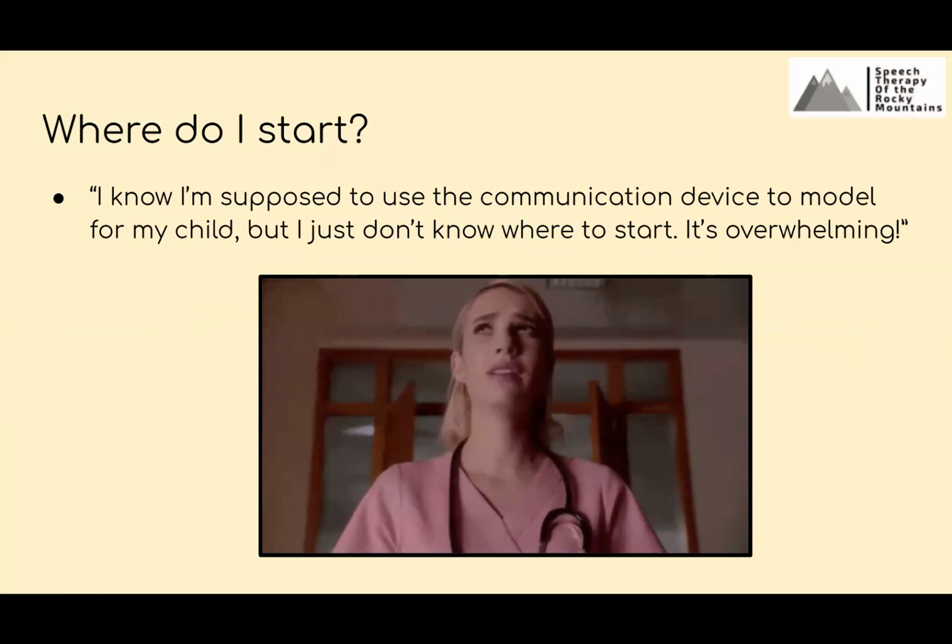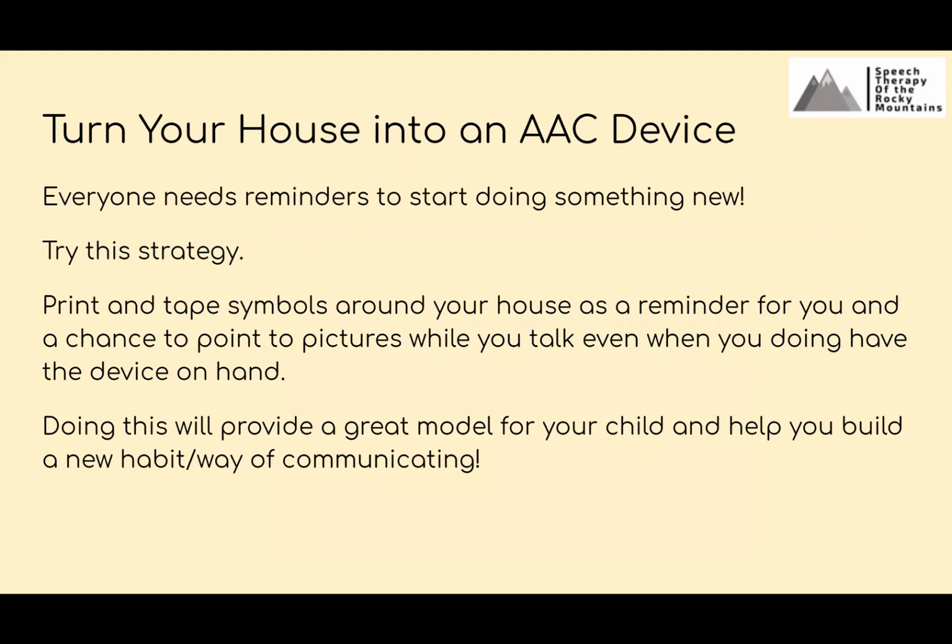Okay, so where do I start? I know I'm supposed to use the communication device to model for my child, but I just don't know where to start. It's overwhelming. So here's the idea for today. Turn your house into an AAC device.